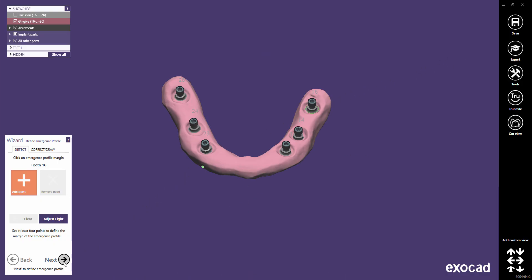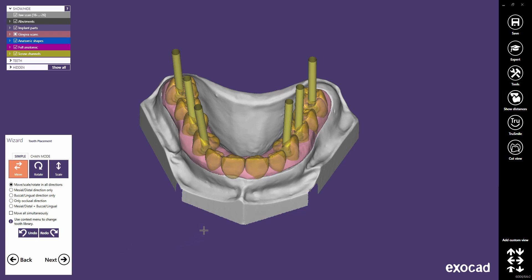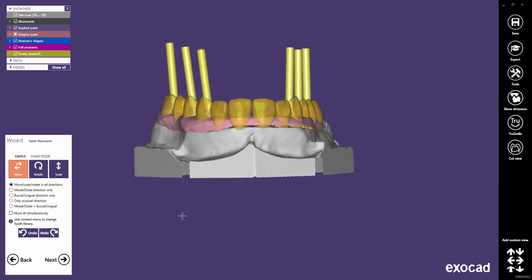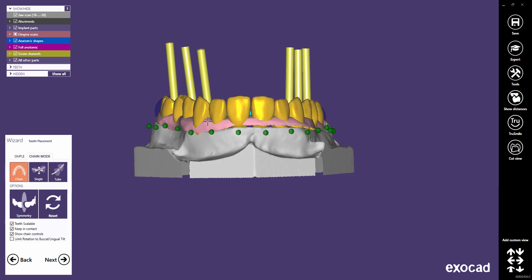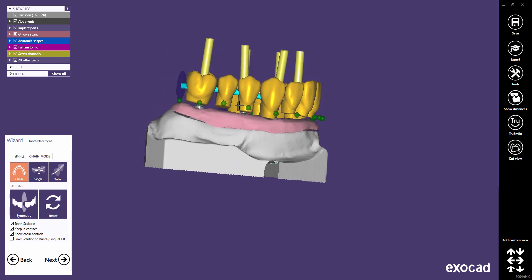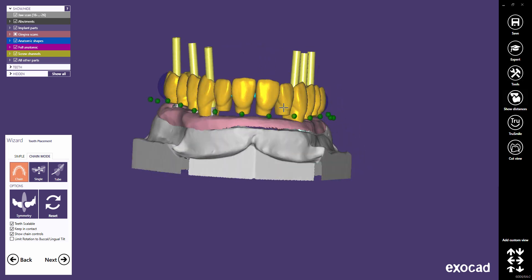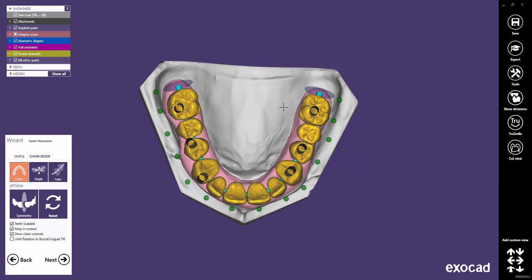If not required, you can skip the Emergence Profile setup and proceed to the next step, which will be the tooth placement. Make sure that you use the correct tooth library. Only Exocad's generic library includes the Thimble Crown shapes. Why not use the chain mode to do the tooth placement? You will find more information about the chain mode in a separate video tutorial. It is a very nice tool to design full arch setups.